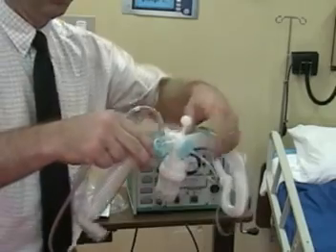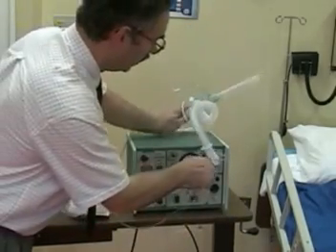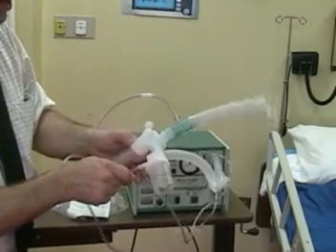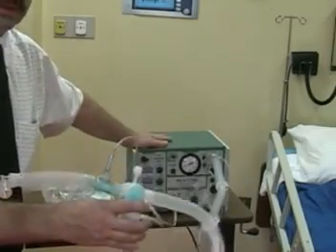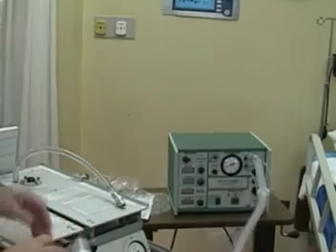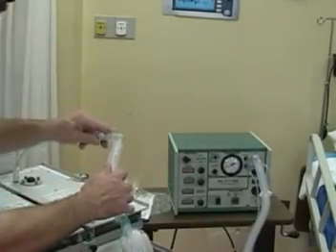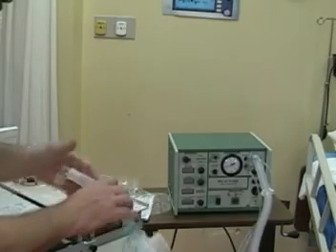That completes the circuit and we are now ready to ventilate the patient. We're going to connect the ventilator to the patient endo tube. Before that, we need to turn the ventilator on and set our parameters.